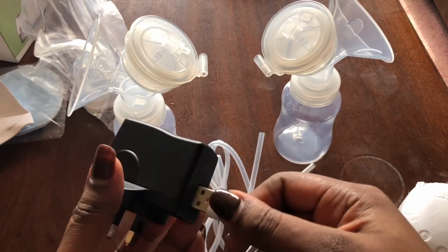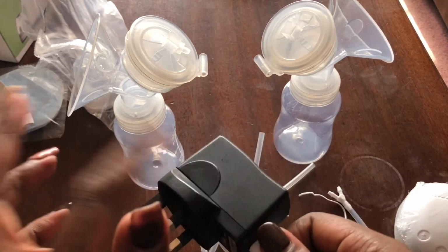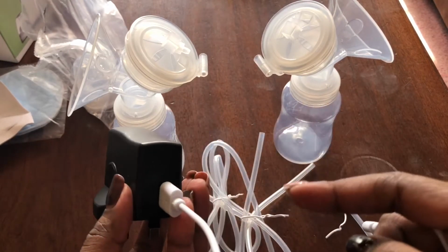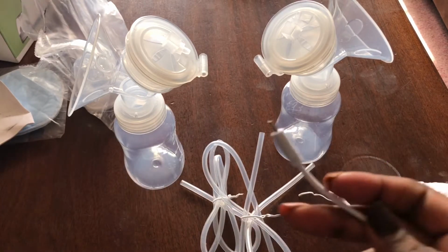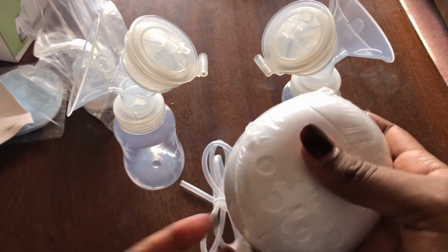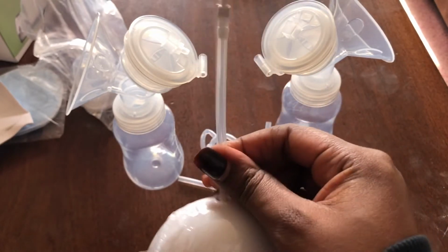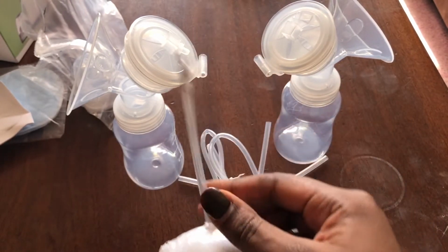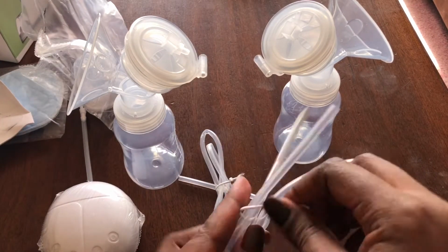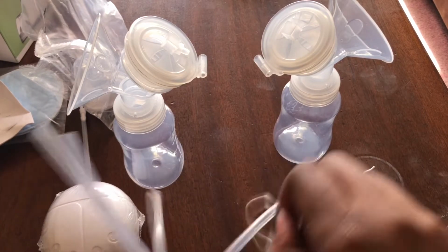Remember, if you're buying the specific pump, I don't know about the other brands for electric pumps, if they have this, but I doubt. So if you're buying this specific breast pump, you'll need this cable. So that goes there, and the end of this cable goes here. In case you're using the double one, you're using both bottles, so this one goes there. And then let's connect these two pipes. This is how we assemble everything.